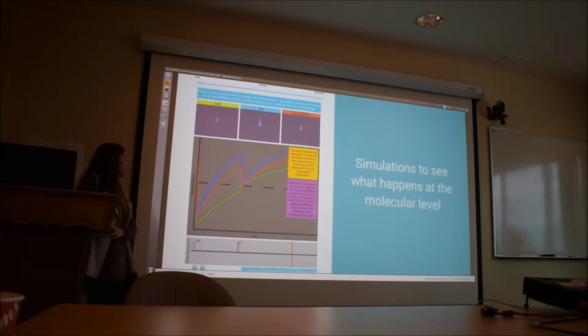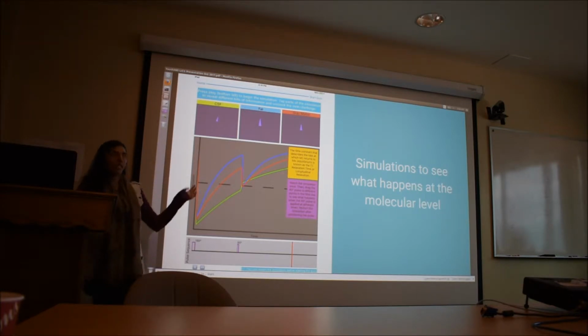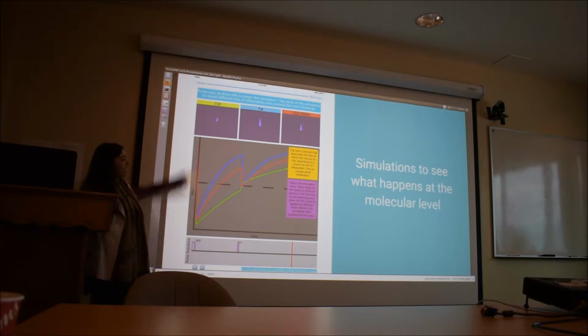What users can do is, the screen essentially starts off blank with the magnetization vectors all pointing up. Then when you apply a 180-degree pulse, the magnetization vectors tip into the 180. If you have a z-axis, which is vertical, then they would tip down.